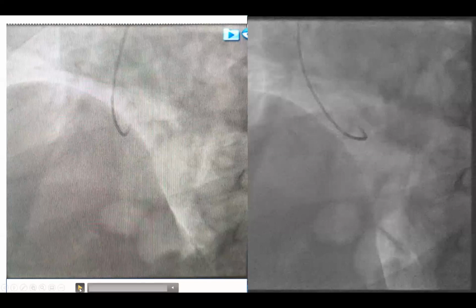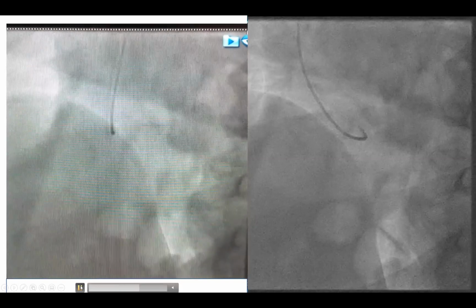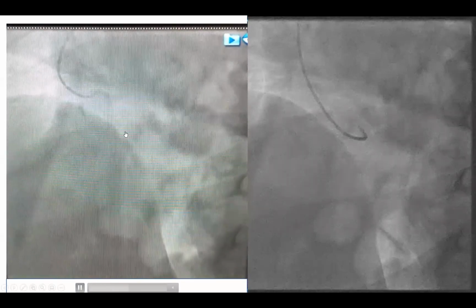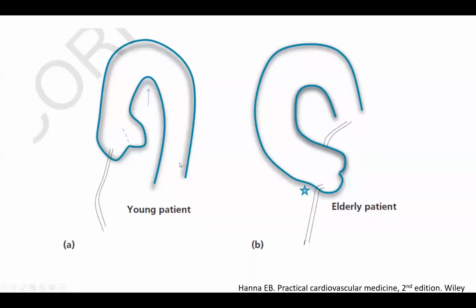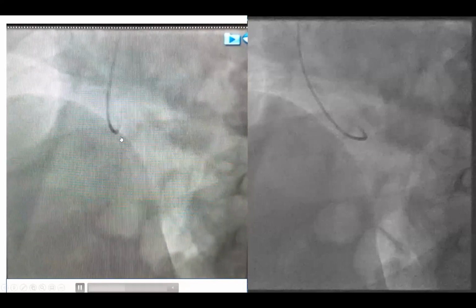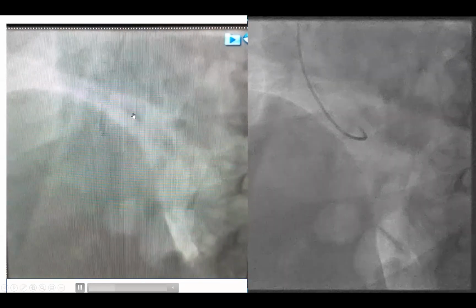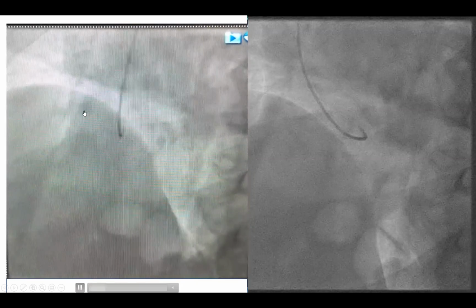So this is an example from this week. This is a patient with a 5.5 centimeter aorta. The fellow is trying to engage here as if the aorta is like this. He's aiming way too high. I knew he's not going to engage it with this. And by the way, this patient has AS, so you see the AS jet hitting the catheter, making it dense. Anyway, he came way too high.